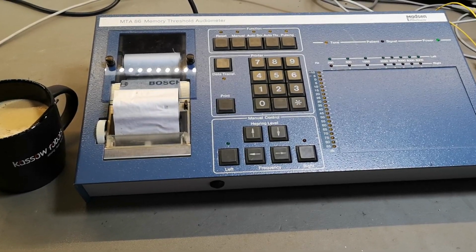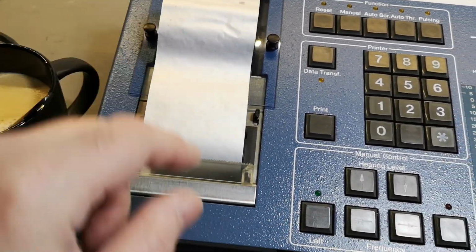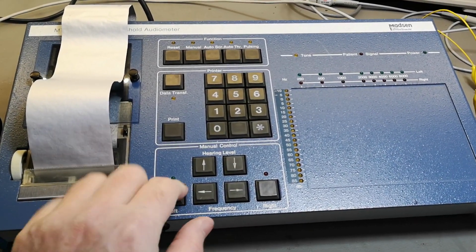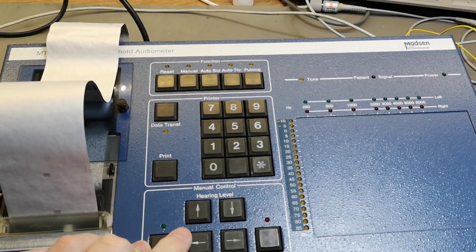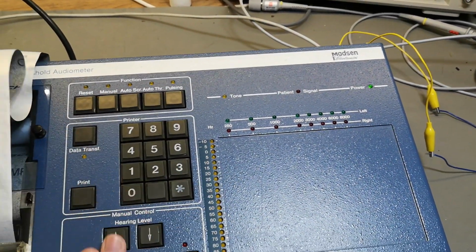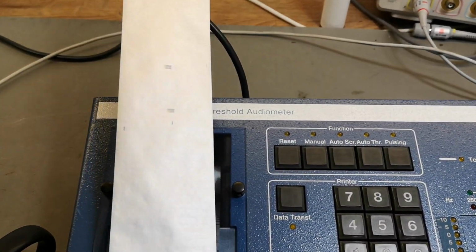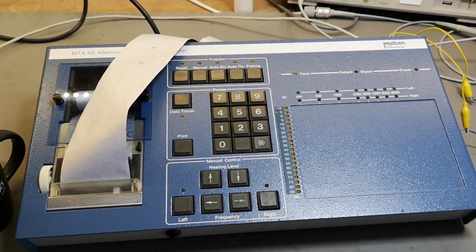Oh my god. Why are you doing that? But it's not... Stop that. Okay, so there's... Why are you doing this? That is a weird... And there was no... See? Oh! Power LED is on. But nothing else. There's not a lot of intelligent written on this paper. Well, let's open and see what's inside.